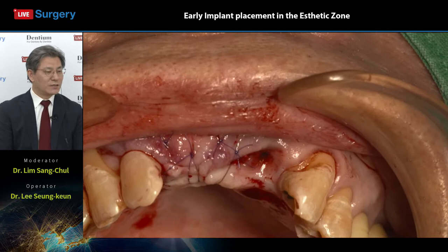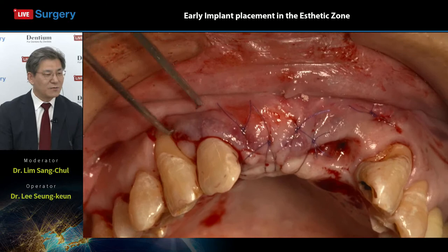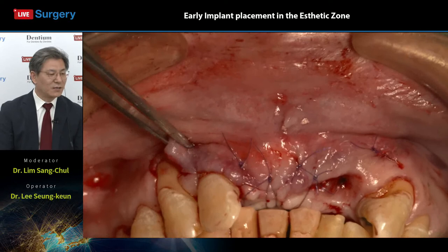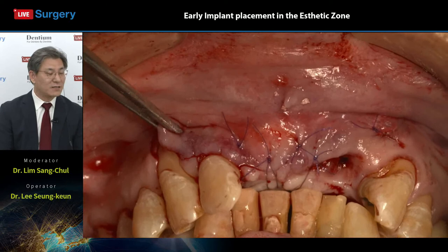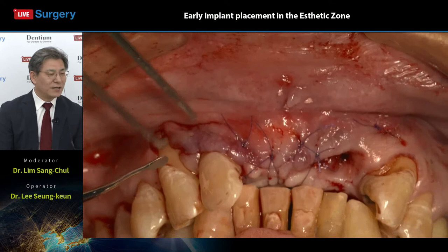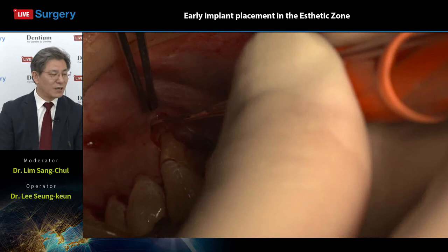So this time we can see the graft material, Osteon 3 collagen alloplastic material. Sometimes the layer technique has another name, the sandwich technique, the same thing, using autogenous bone inside and an alloplastic portion outside. The outer portion of alloplastic graft material gave us a stable volume, and the inner portion of autogenous bone gave us good new bone formation activity, right? So both activities can be obtained with this layer technique.